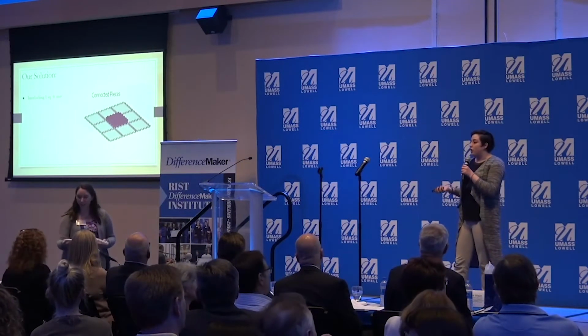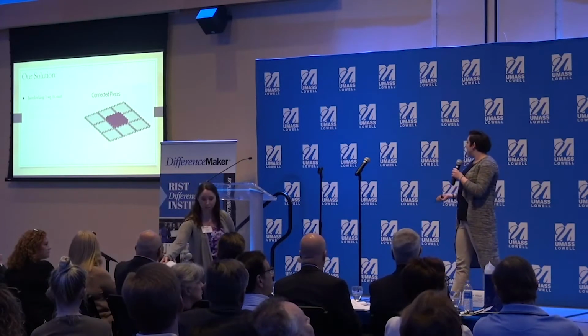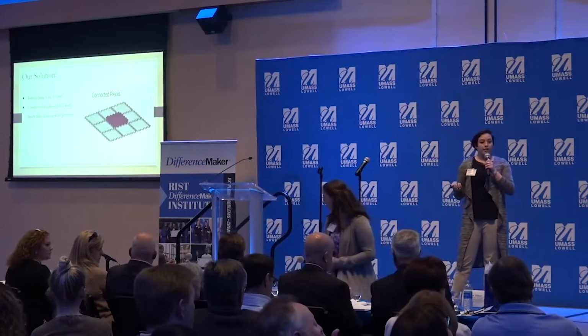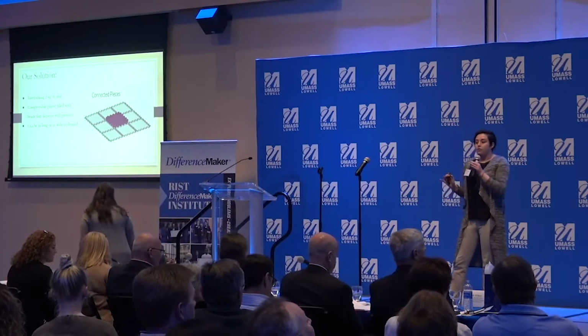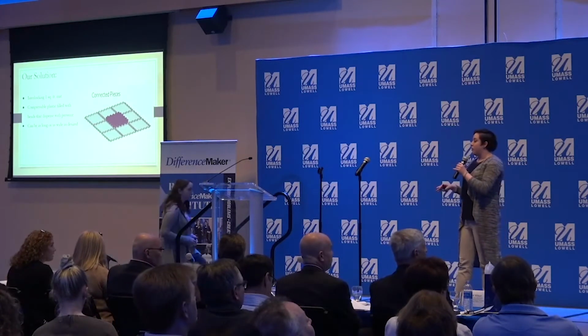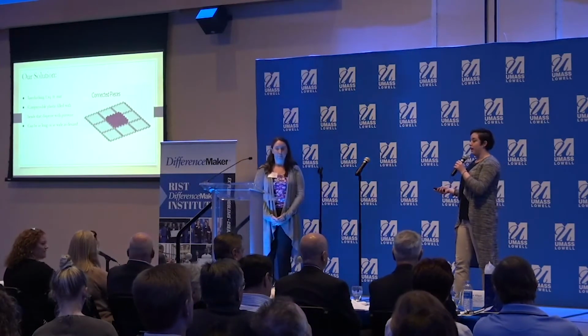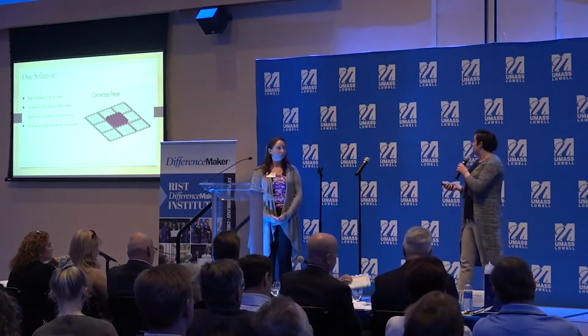This is an interlocking puzzle piece mat system that's 1 foot by 1 foot in dimensions. It's going to be made out of a compressible top layer and filled with various size compressible beads. So the idea is that when you step on this mat, the beads inside will disperse and create a different orientation when you step on it every time. That way it'll feel like you're walking on an uneven surface or like you're outdoors.